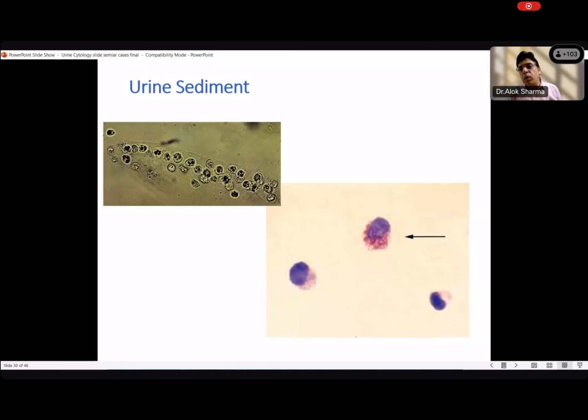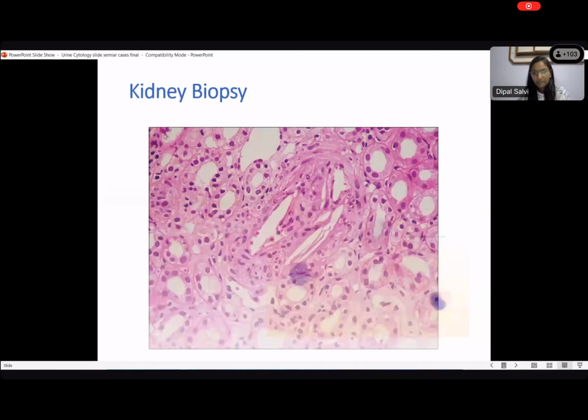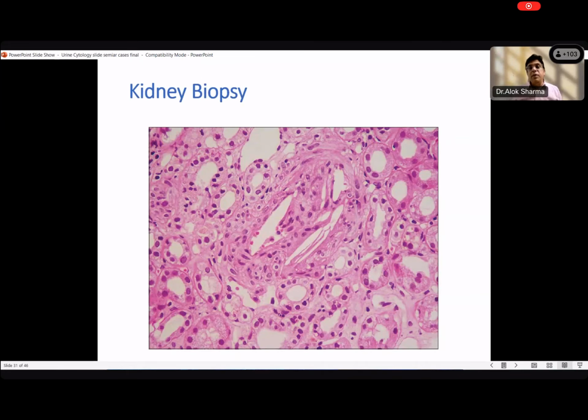So in this particular case, the patient has had a history of CABG, and whenever such patients are seen by surgeons or physicians in the post-op period, you will always get a specific request for urine eosinophilia. And why is evident in the next case. So somebody can just describe this. Maybe Shita, you can describe this image. This is a renal biopsy, which is showing some finding. Can you identify what finding this image shows?